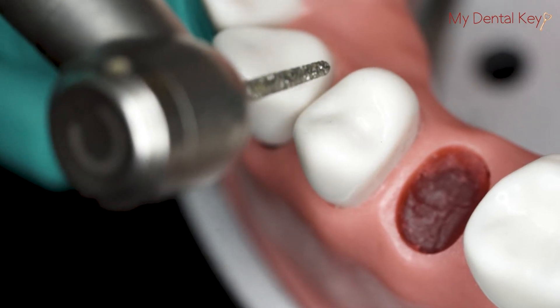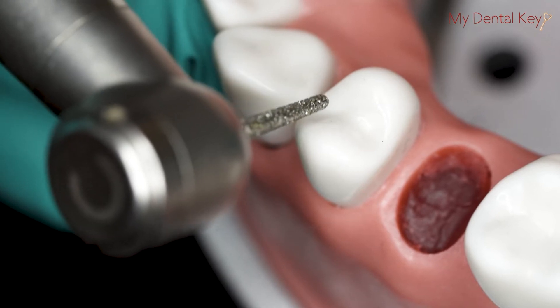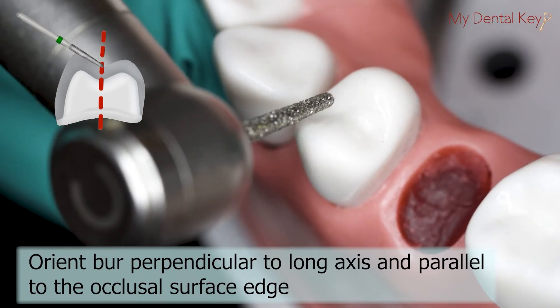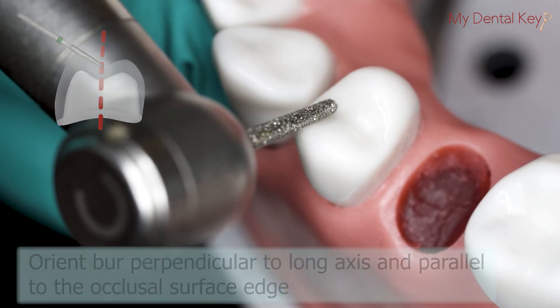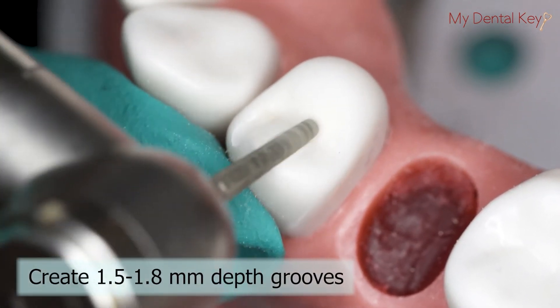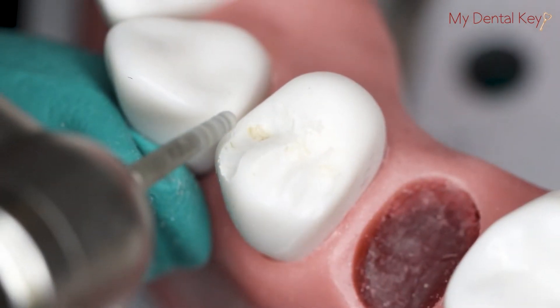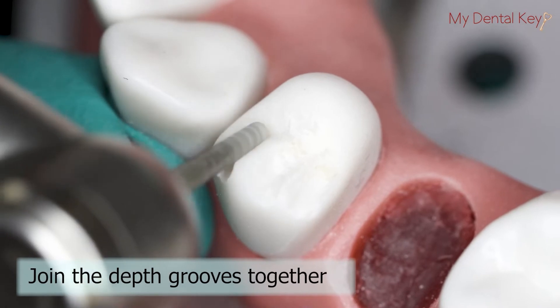Once the putty indices are complete, we can move on to the crown preparation, starting with the occlusal reduction on tooth number 5. Orient the burr perpendicular to the long axis of the tooth and parallel to the edge of the occlusal surface. Create depth grooves at 1.5 to 1.8 mm depth. This allows for the additional loss of tooth structure during reduction and finishing. Then join the depth grooves together and remove any roughness left by the grooves.